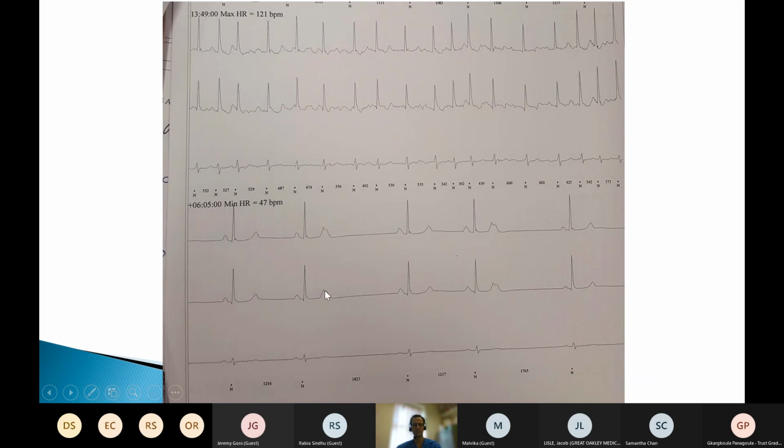And that is going to be an atrial ectopic, which is arriving probably early to the point that it's not followed by a QRS because it's too early to capture the ventricle. So this is frequent atrial ectopy at night causing this relative bradycardia. And this is not a reason to be concerned in this patient. If you had a longer pause, it would be, or if you had signs of 2-to-1 heart block, it would be, but this is okay.